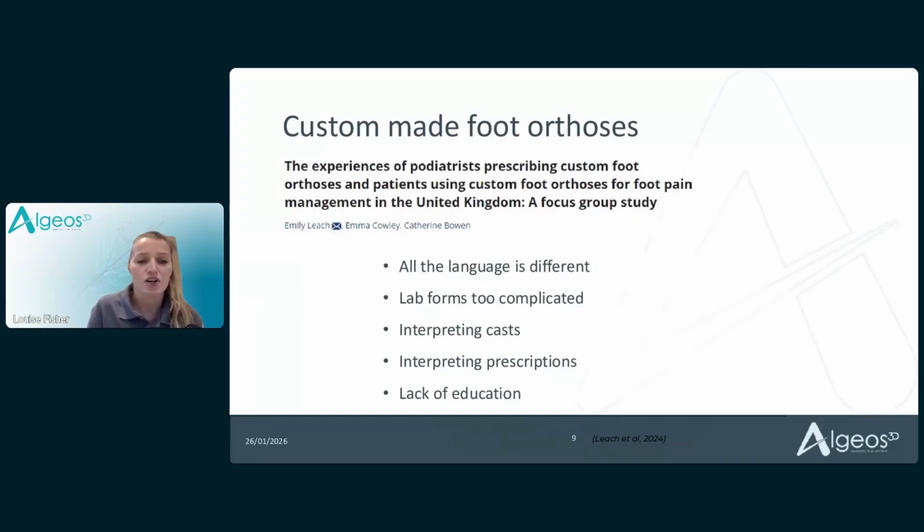The other concern was that there was so much interpretation related to what you put on a form as a clinician, what the lab interpreted from that form, and then how the lab technicians would alter and modify and create the mold in order to give you a finished device.